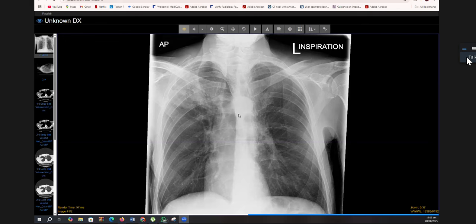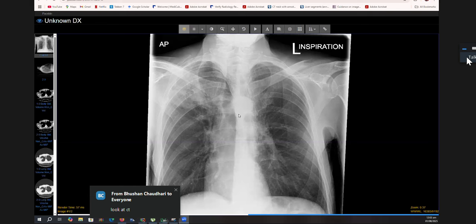Sir, I will not look at it. Oh, no, no, no. You must look at the thumbnails. Just make it look as if you're not looking at them. It gives you added information and it just confirms what you think when you look at the chest X-ray.